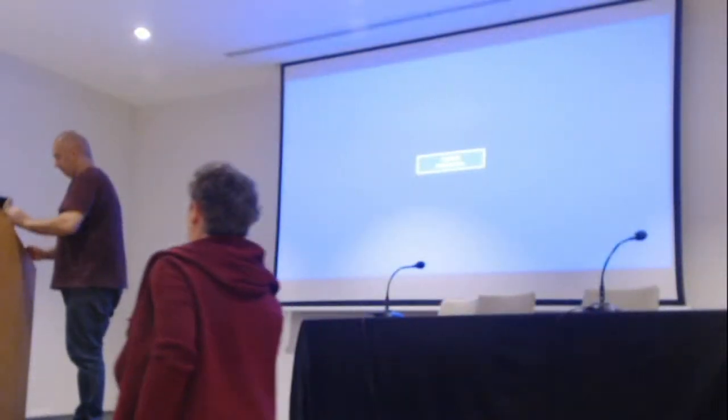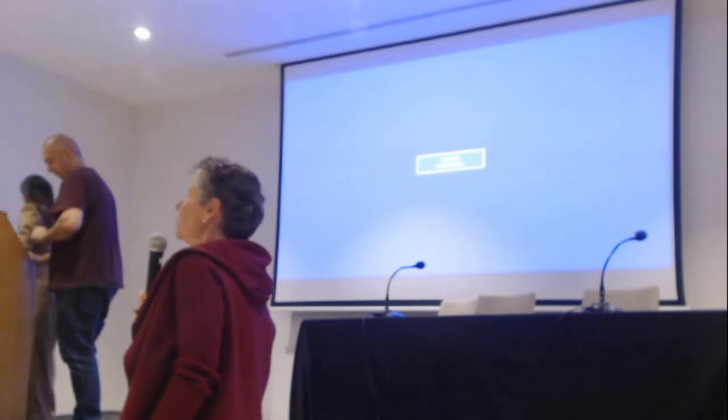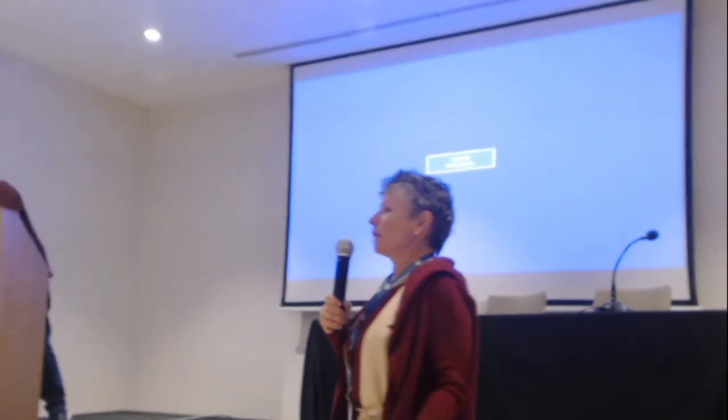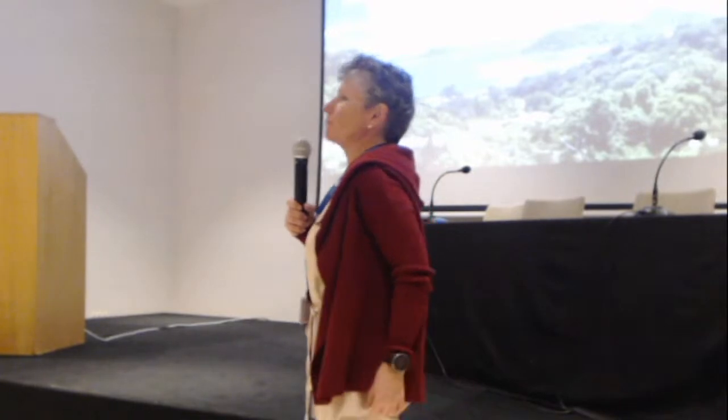Thank you very much, Margarita. This was the perfect last talk of this course, just summarizing not only the 3D options that we have, but also the importance of 3D for diagnosis in obstetrics. So Margarita and Peter, if you want to go up for a few questions.